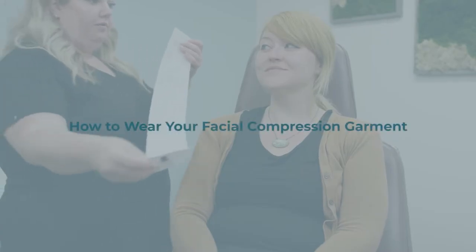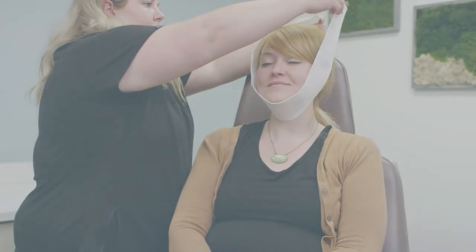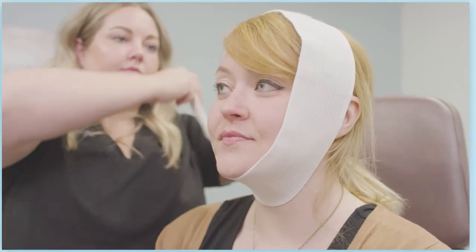This video is intended to give you all the instructions you need for the use of your facial compression garment. The facial compression garment is important to achieve the necessary compression around the surgical site. The garment has no seam and usually fastens with velcro.